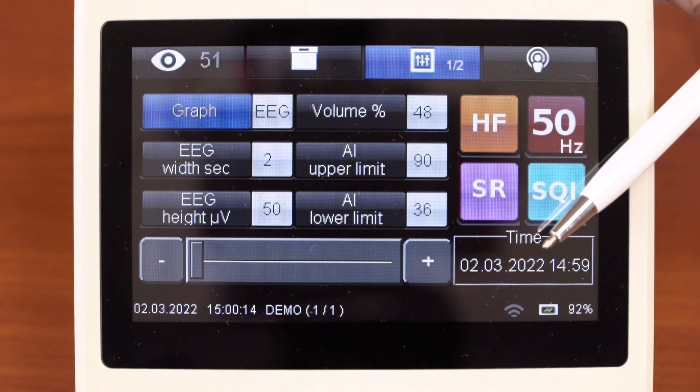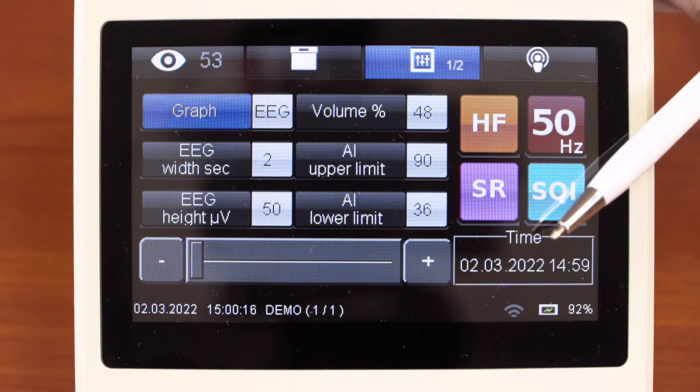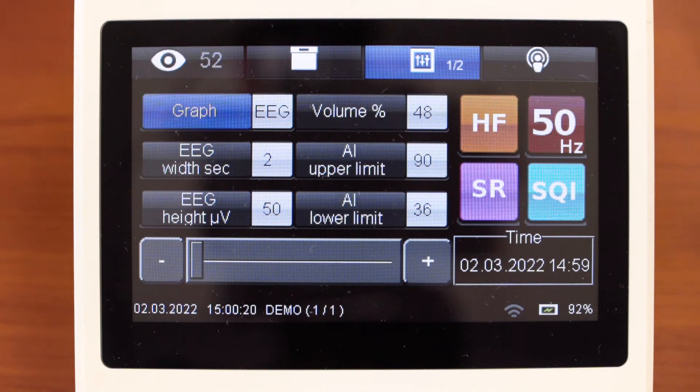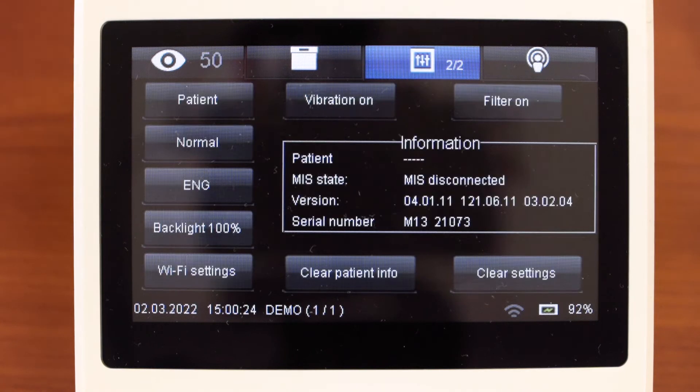Here you can set the date and time. Use plus and minus to change values. Press settings button again and you will see advanced settings.